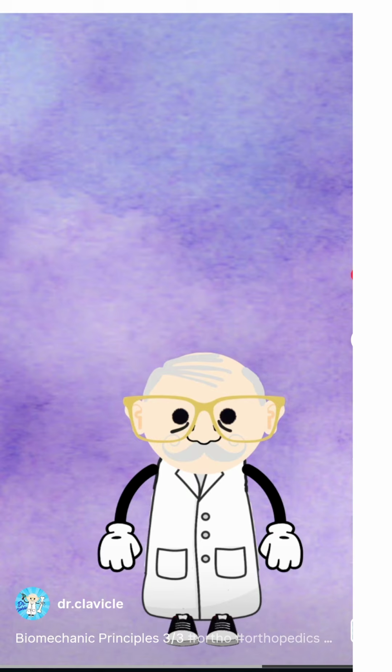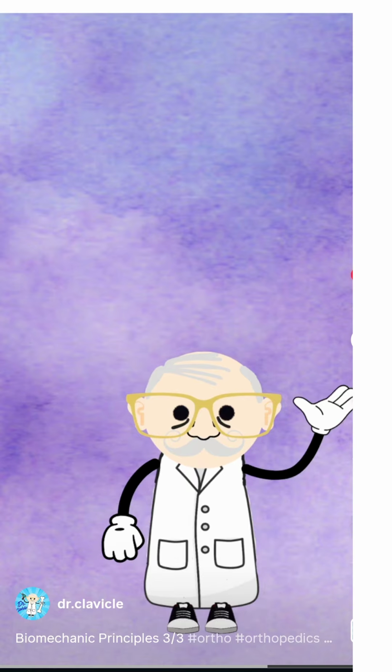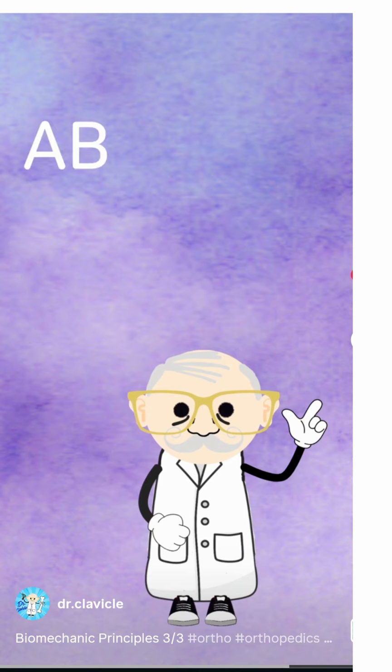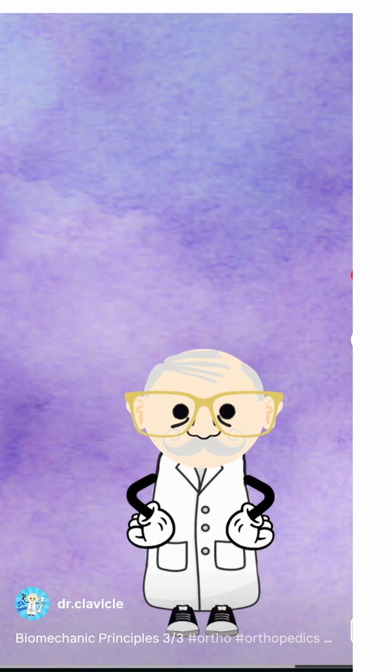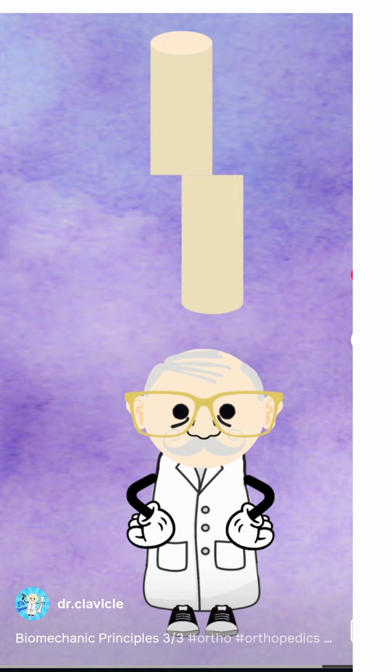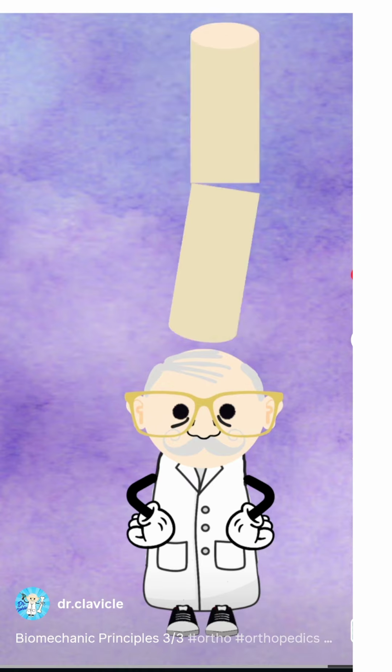Next subject is compression. Compression in osteosynthesis means clamping the fracture surfaces firmly together, so the two fragments act like one continuous bone. The goal is absolute stability. Biomechanically, compression works because the squeeze creates a strong pressing force between the bone surfaces. That force increases friction at the interface, so it prevents shear and reduces gapping when the limb is loaded.